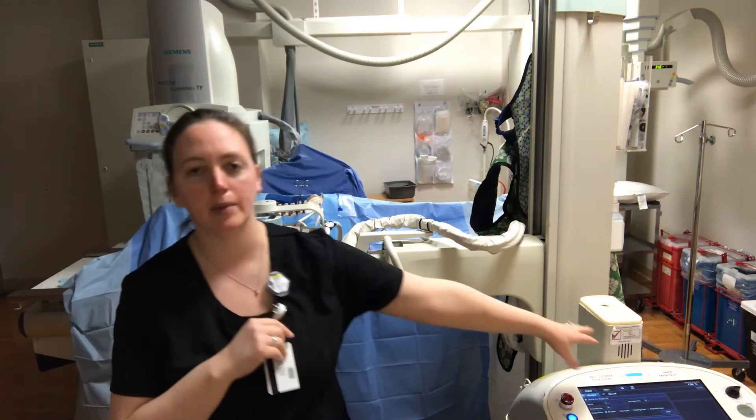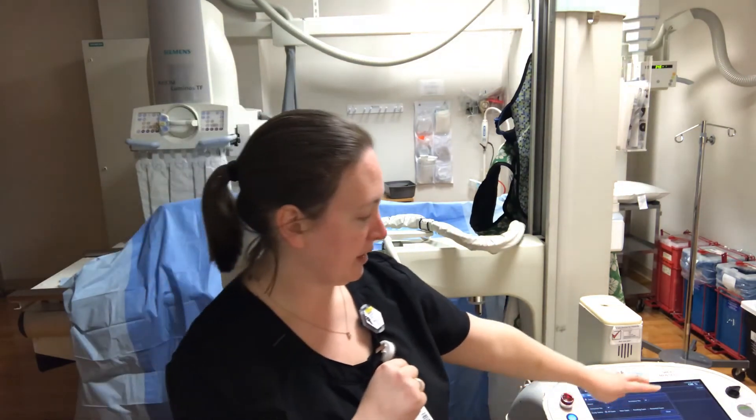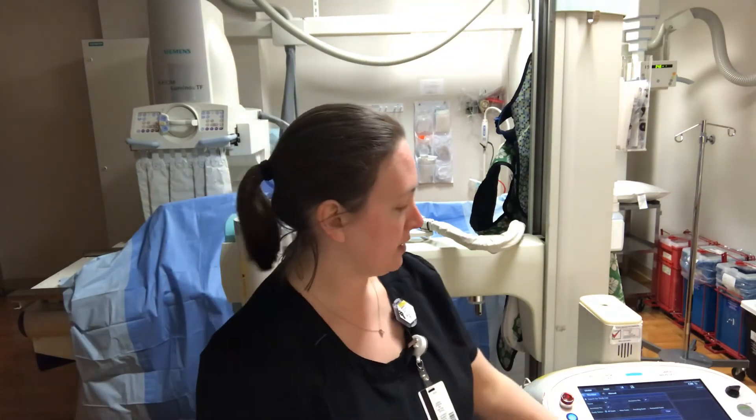You'll bring your name up on the screen — it'll be spine single view. I usually pick either lumbar spine or cervical spine, whichever one I'm doing, and set technique from there. For digital Shimadzu lumbar spine shoot through in the OR, around 40 to 50 inches at 90 kVp — 63 to 95 mAs for a bigger patient, something like that.